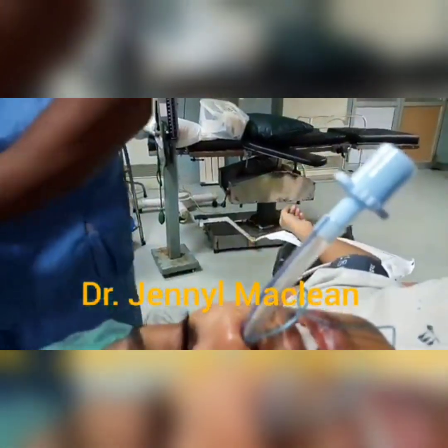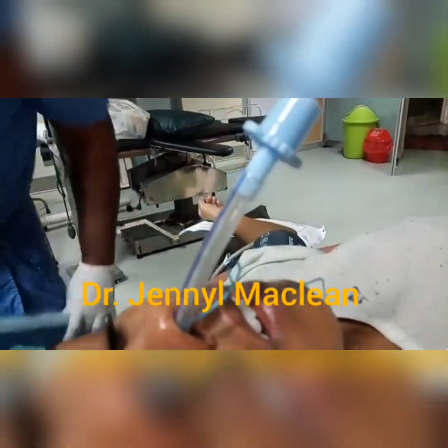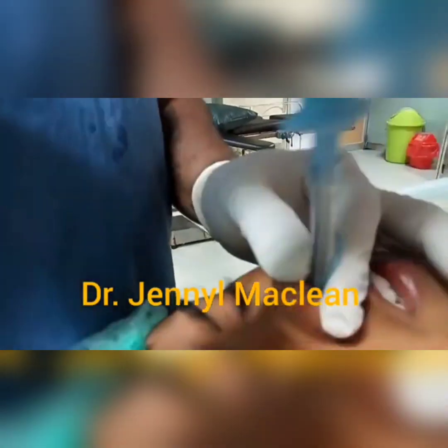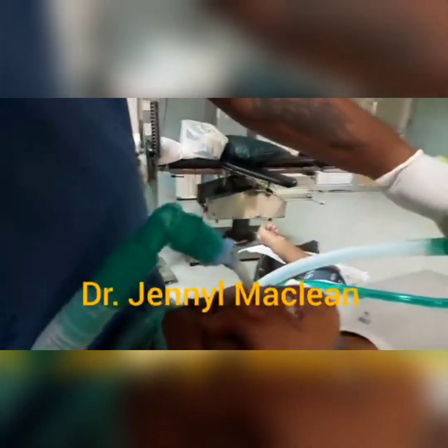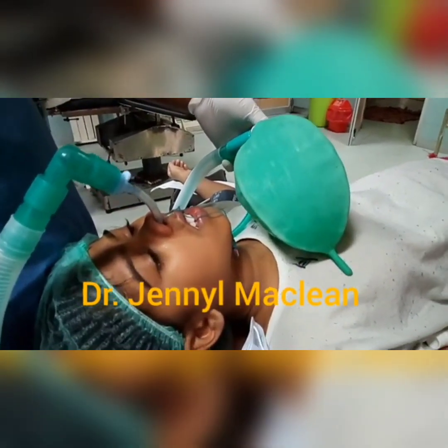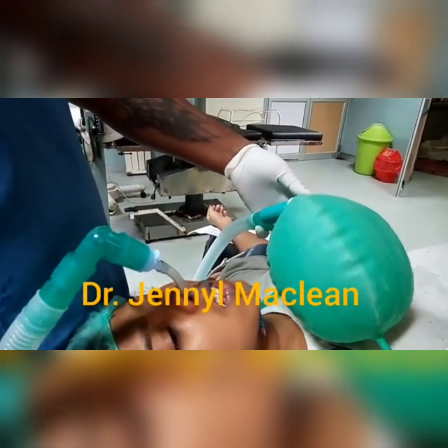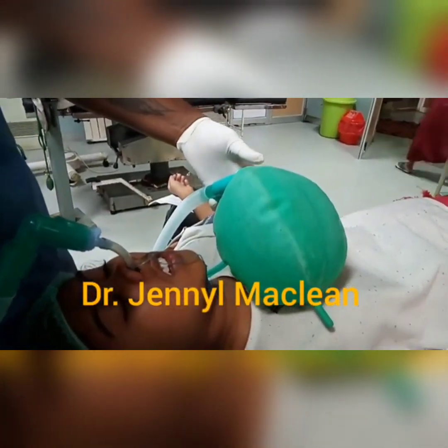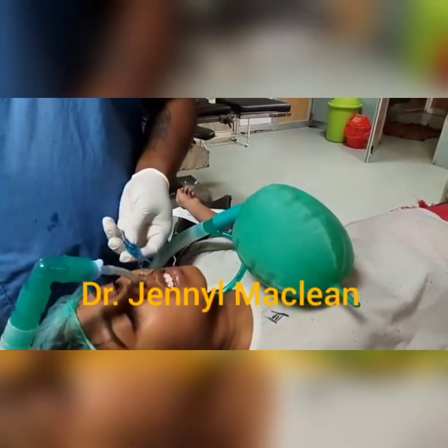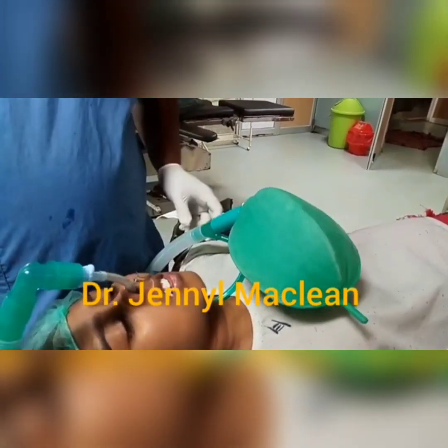If you don't have an ETCO2, connect your Bain circuit. The patient is awake. The fogging at the endotracheal tube is the best way to confirm it. Now I attach my Bain circuit and you can see the bag is filling for both inspiration and expiration. With just 6 litres of oxygen, when I ask her to take a deep breath, the bag is moving accordingly. This is the best way to confirm it. Then you can inflate the cuff and proceed with the routine procedures for general anesthesia. These are things you can do when a patient is coming for a difficult airway.